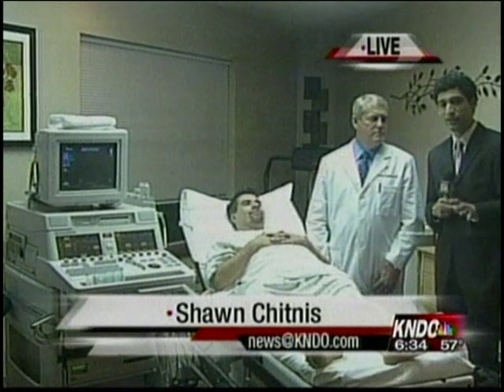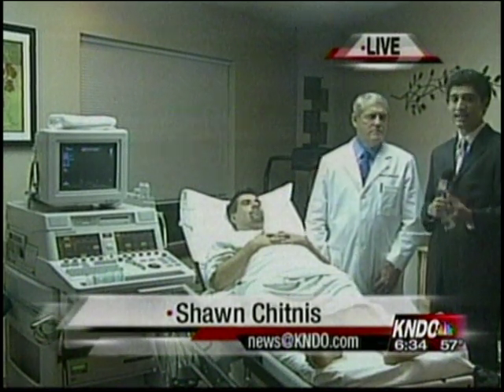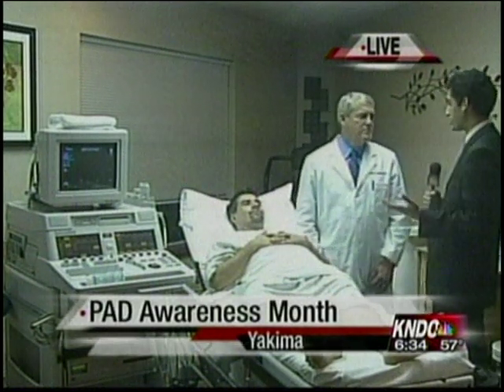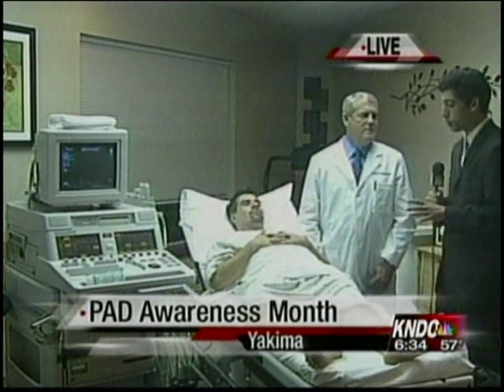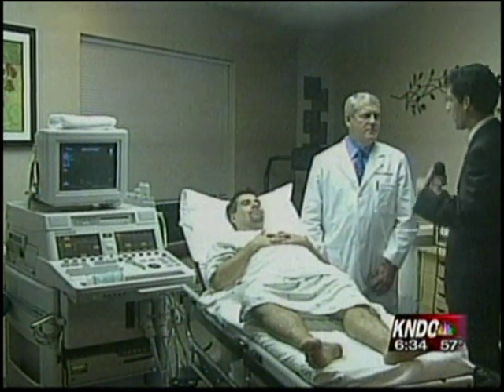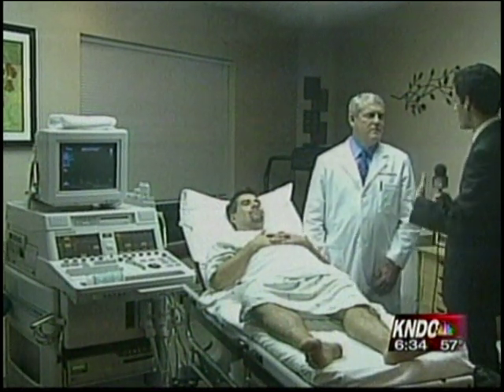We are back here at Pacific Vascular doing the next step in the testing process, joined again by Dr. Justin Robinson, who is with Yakima Vascular Associates. And Doctor, last half hour we took a test for our patient Shay here to figure out if he had PAD. And we're going to pretend that now he does, and we're going to do the next step.